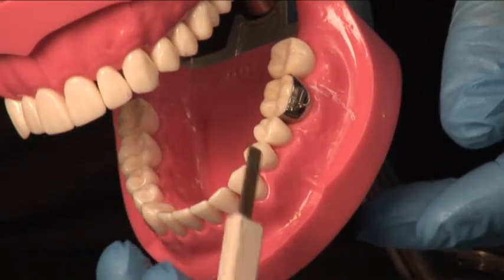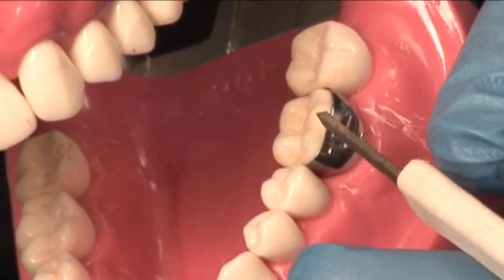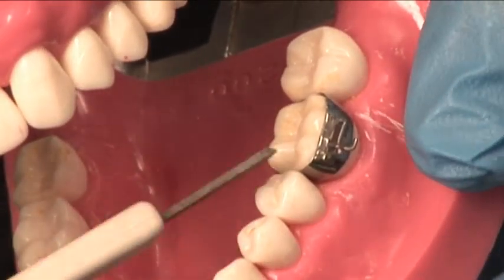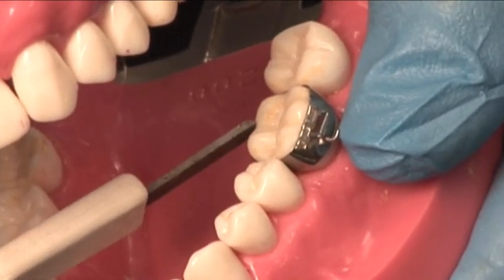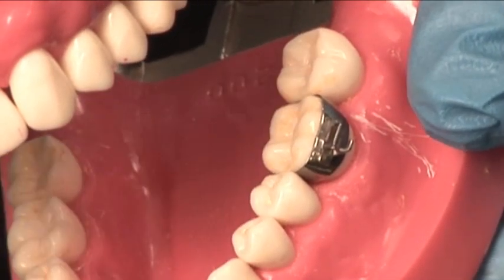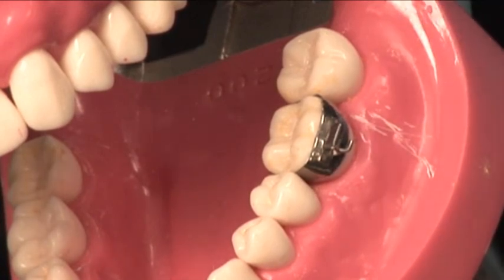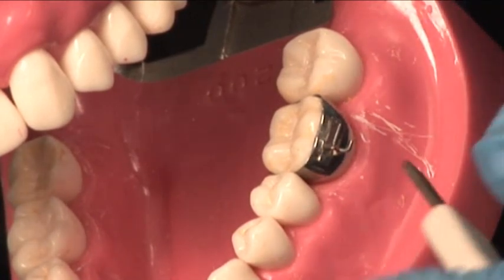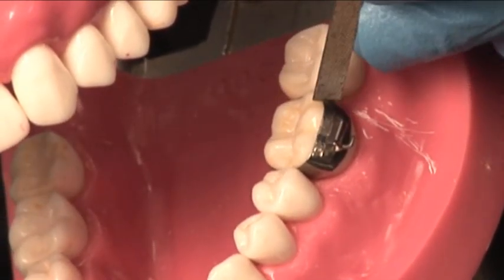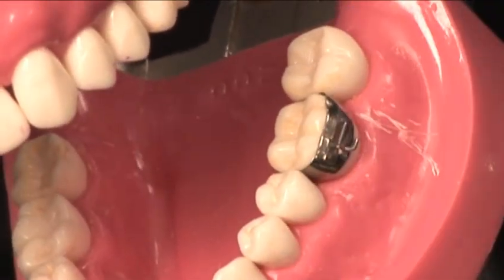Once you get the band on the tooth, what you want to do is come in to the mesial groove, and you want to contour that band in like that. Come into the lingual, contour the band in, and then interproximal, if necessary. When you look down on the band, it has gone from the shape of the band that was made to more of the shape of the tooth. So it fits those little grooves, so you won't have open margins when you cement the band.